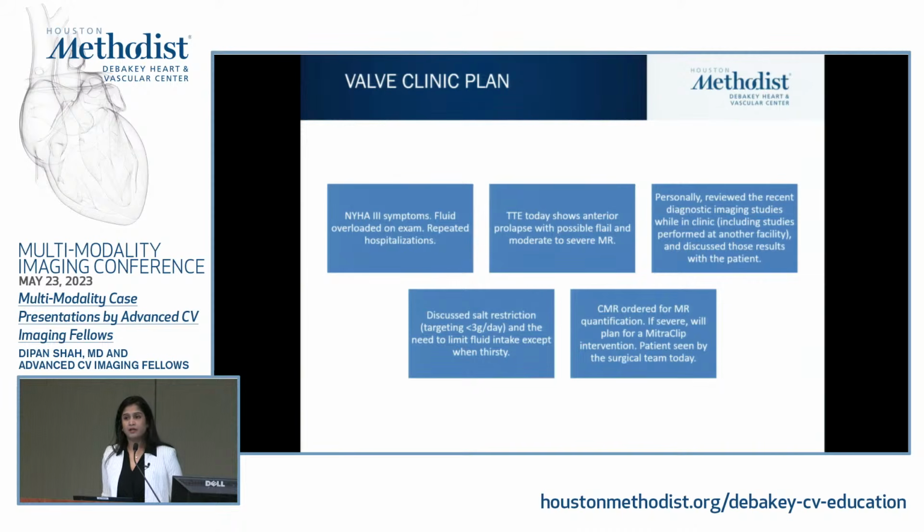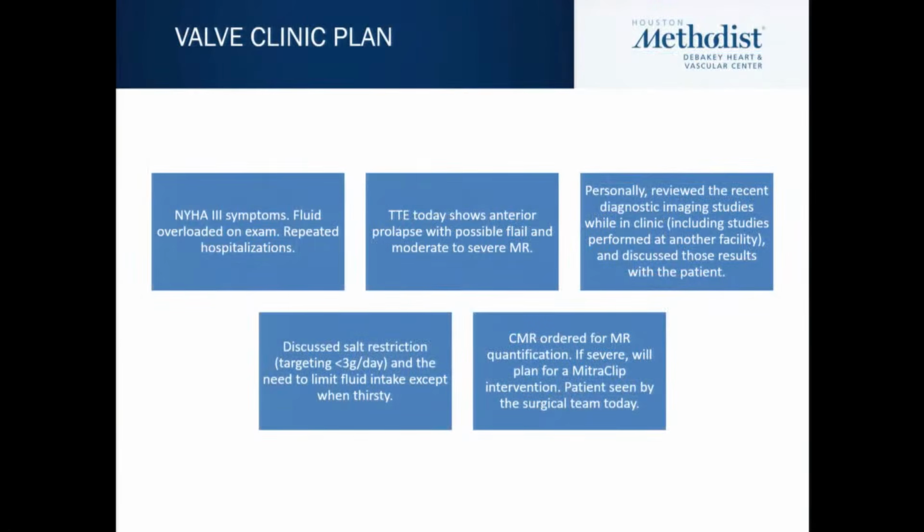and I would like to bring your attention to each one of these points. It is of utmost importance to first evaluate the symptoms of the patient. What is this valvular lesion doing to our patient? The significance of the disease, and then also review the images of the imaging studies that were done at our institution or elsewhere. This is one of the crucial things that we do in our clinics, maybe valve clinic or general clinic: always personally review the images themselves.